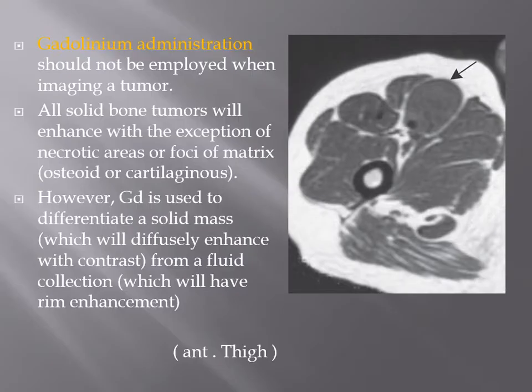So as we can see, this is important for lesions. Now, gadolinium administration should not be employed in imaging, especially if you suspect a bony tumor, because nearly all bony tumors will enhance, except if there is a necrotic area or foci of calcifications. However, gadolinium administration is used to differentiate between solid tumor and fluid, because solid tumor will enhance with contrast and fluid will have a rim enhancement.